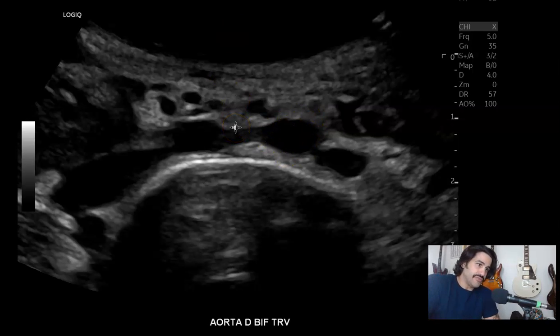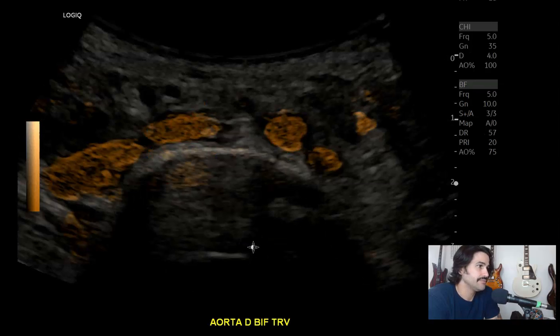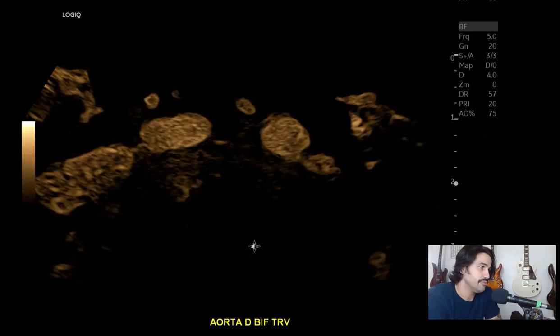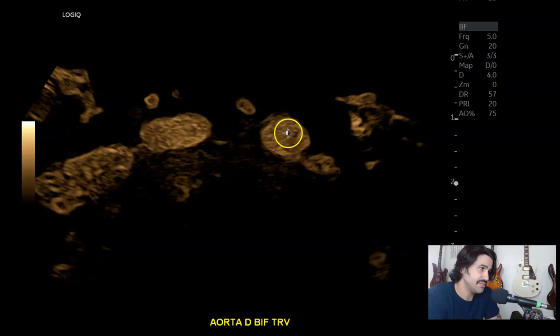You can get this from midline — transverse around the level of the umbilicus. Right common iliac artery, left common iliac artery, vertebrae, right common iliac vein, left common iliac vein. With color, B-flow hybrid mode, B-flow regular mode — you see the flow at all four of those vessels. So definitely the bifurcation of the aorta and the confluence of the IVC.